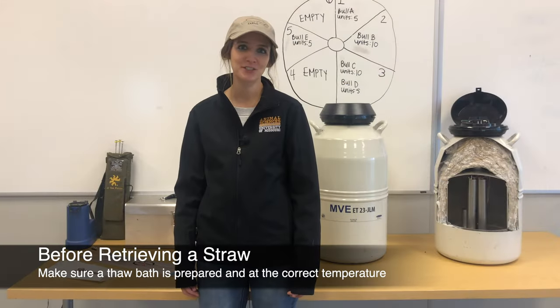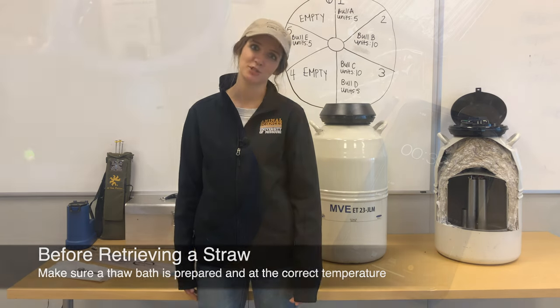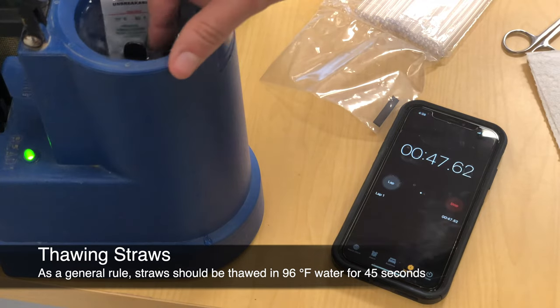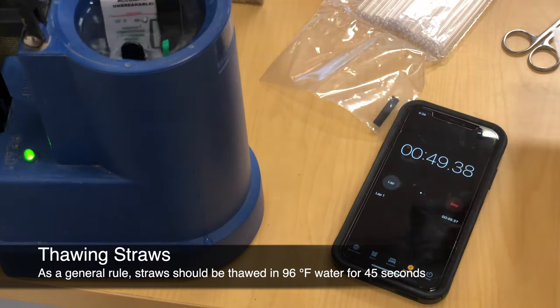Before retrieving a straw, make sure a thaw bath is prepared and at the correct temperature. As a general rule, straws should be thawed in 96-degree Fahrenheit water for a minimum of 45 seconds. Other thawing procedures may be acceptable depending on the extender used in production of the units.